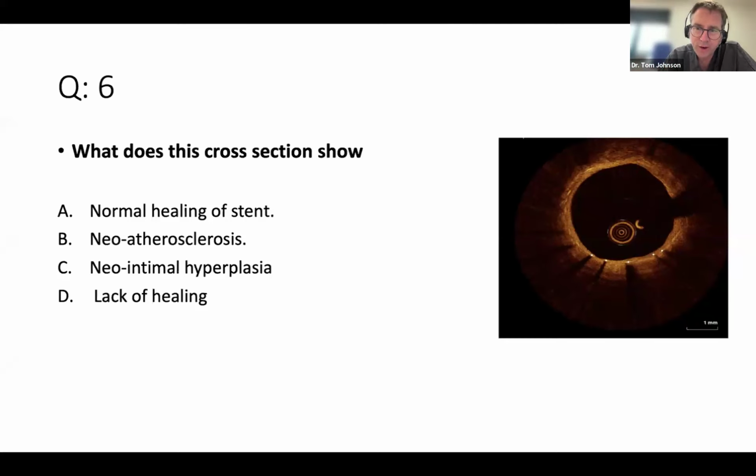And then the only other area where it's slightly more ambiguous is from about 12 o'clock, 1 o'clock round to 4 o'clock, where there is this arc. Interestingly, we're increasingly interested in the dynamic nature of how patients develop plaque, or intima, or layering of plaques. It may well be that this was where there was adherent thrombus on a stent strut, which has then become endothelialized.